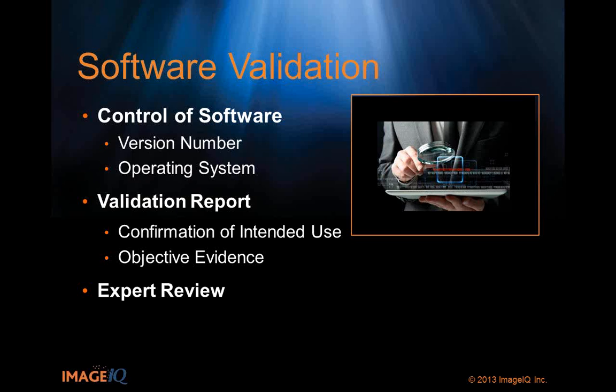One of the things that you can do is, we term it confirmation of intended use. You can create a phantom image, or set aside a set of test images, where the radiologist, in conjunction with his software or your customized software, if it's an image that you developed or some other vendor's, has gone through that phantom image and made the appropriate measurements correctly within a tolerance, right? And then you need to show evidence that that's happened. You have to have it as a report.